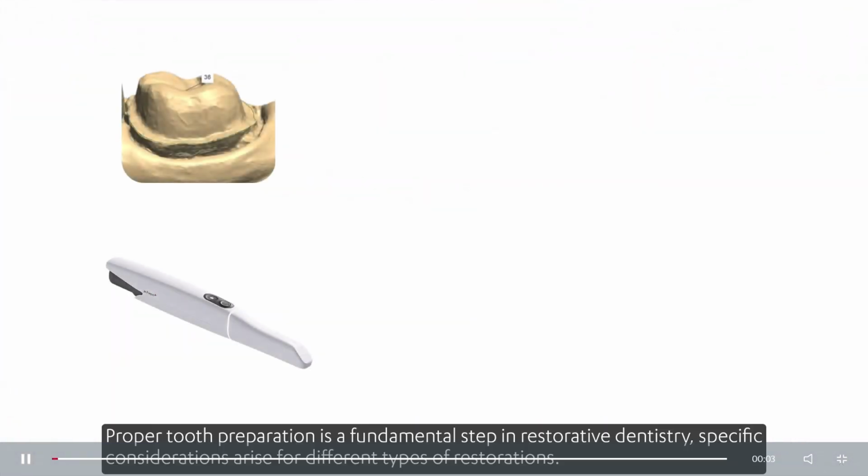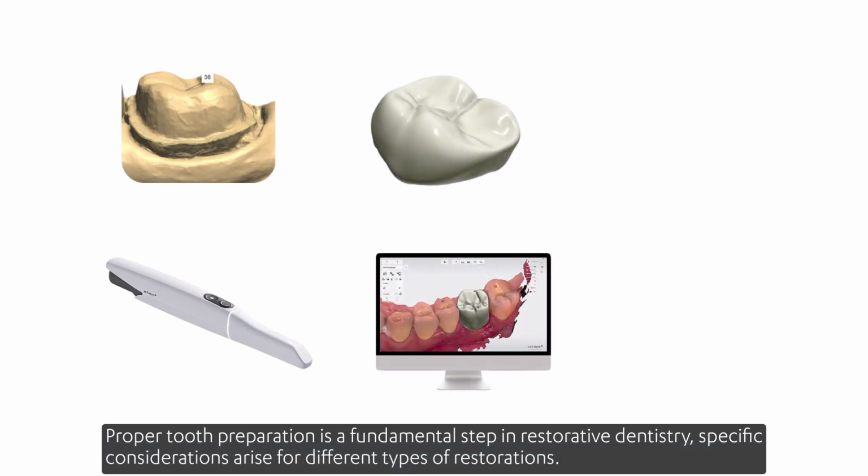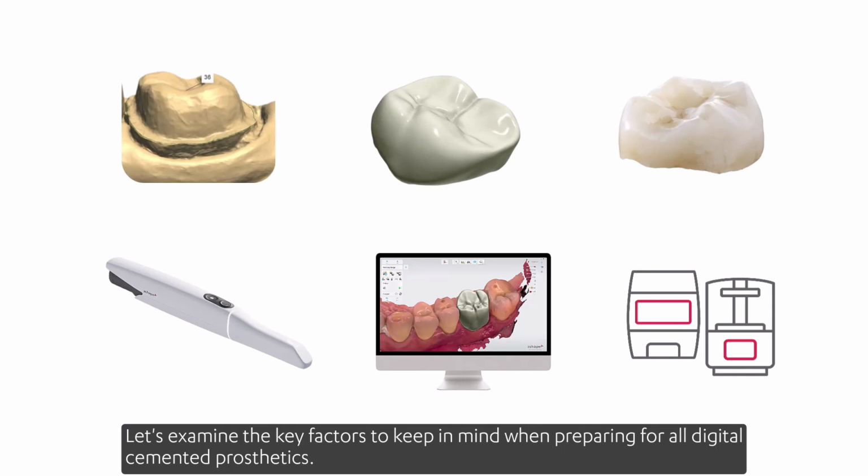Proper tooth preparation is a fundamental step in restorative dentistry. Specific considerations arise for different types of restorations. Let's examine the key factors to keep in mind when preparing for all digital cemented prosthetics.